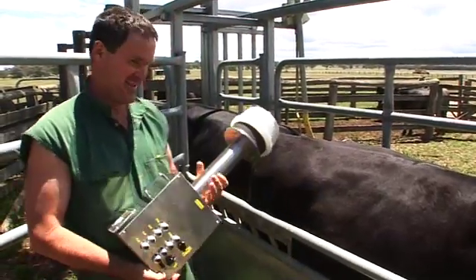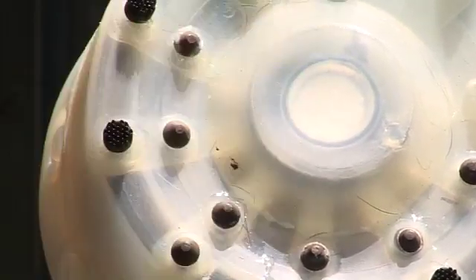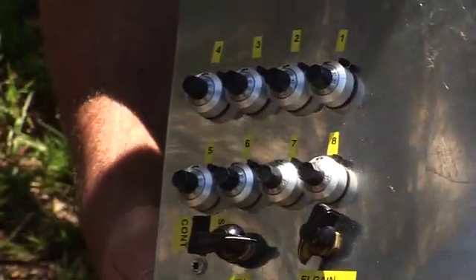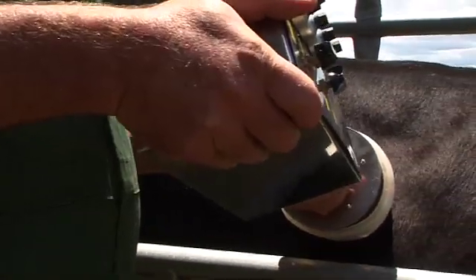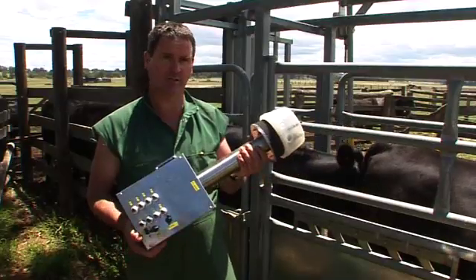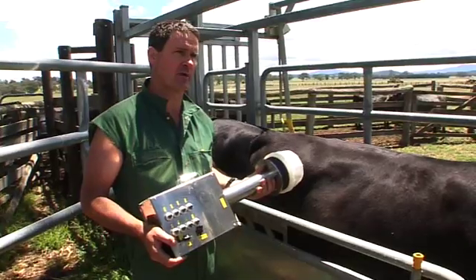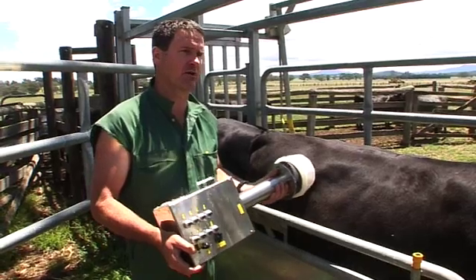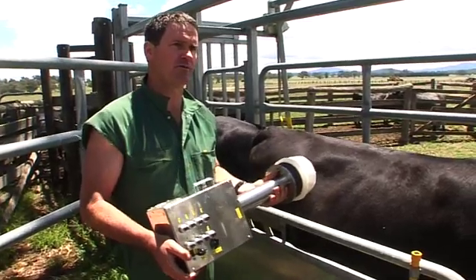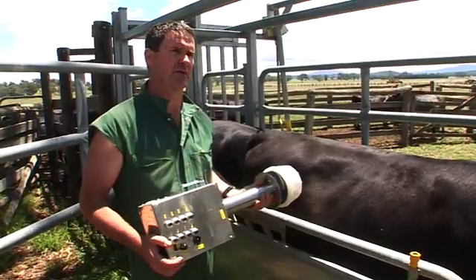The portable scanner uses electrical and audio sensors to pick up the foetal heartbeat. It's still very much in development, perhaps two years off being commercially available. But early field trials have produced promising results. It's a research tool at the moment, which is why it's large and clunky. This technology definitely works, but I want to be able to hand it to something like a sixteen-year-old ringer or a herd manager and know that they can use the device with confidence and get accurate results.